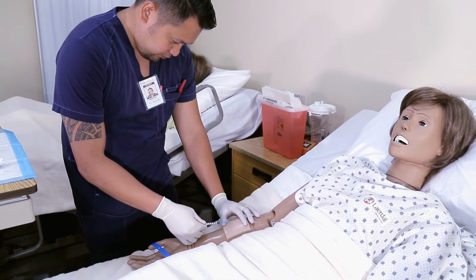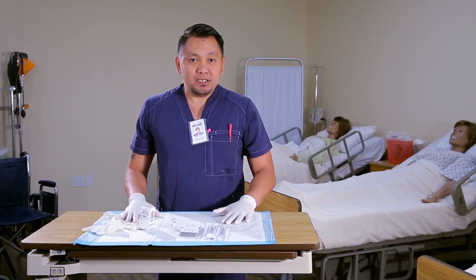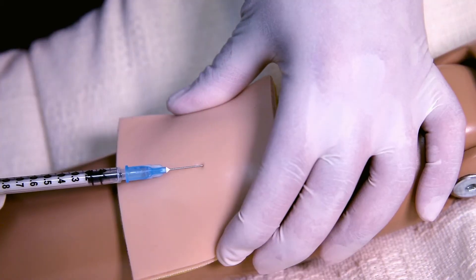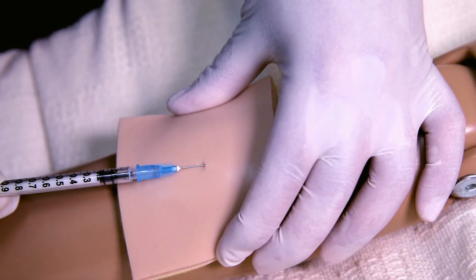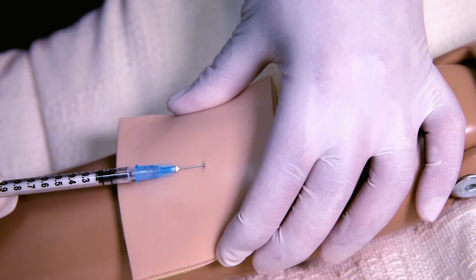With the non-dominant hand, stretch the skin over the site using the forefinger and thumb. Inject the needle slowly at a 15 degree angle, bevel up, advancing no more than one-eighth of an inch under the skin.